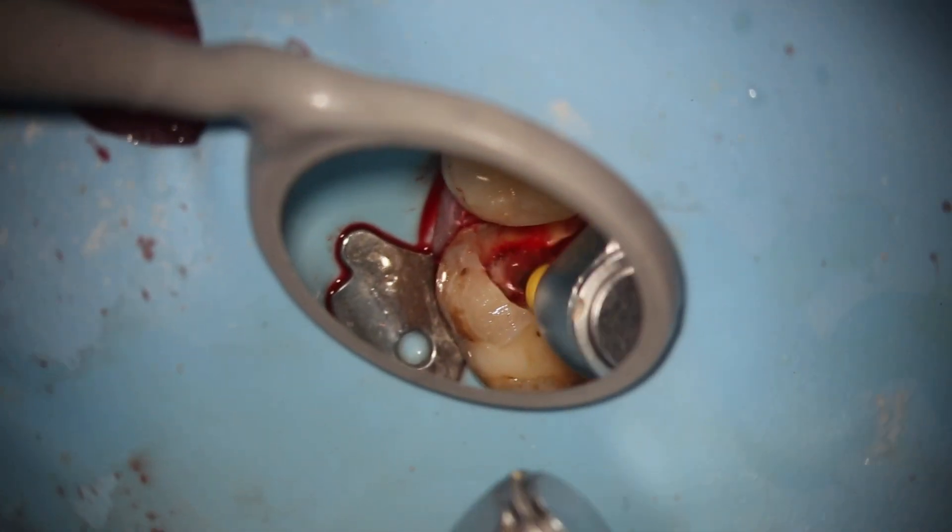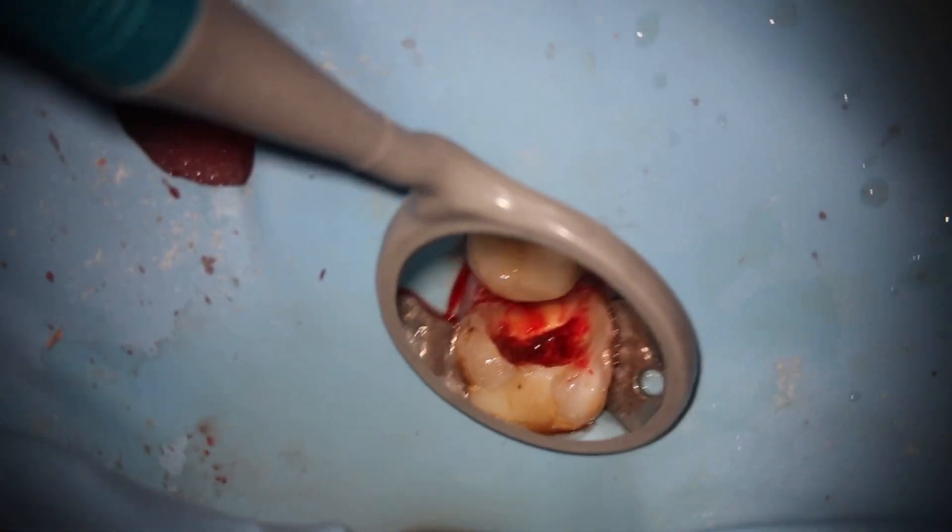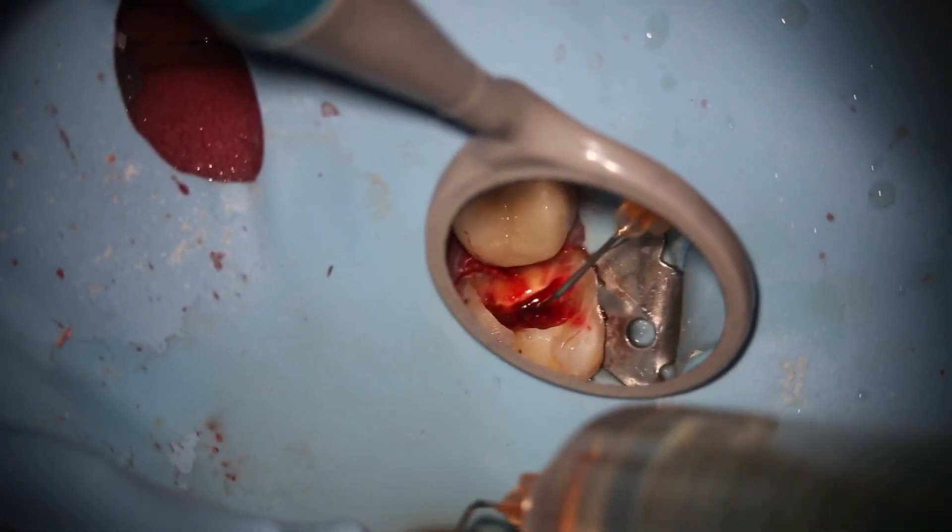When you open the top it's easier to get to the bottom — open the top of the tooth to get to the apex. There's the palatal: I flared, I brushed to the outer wall, the palatal wall.